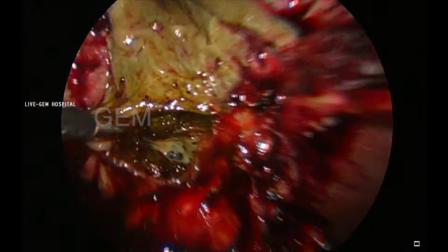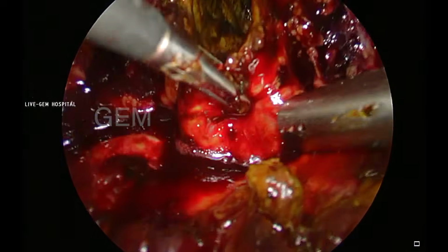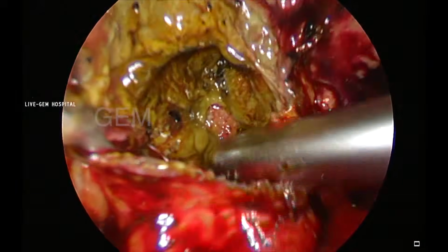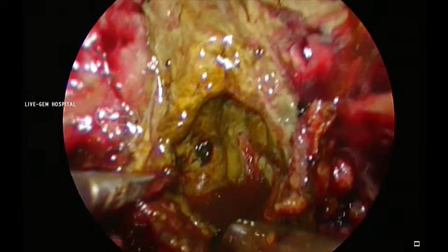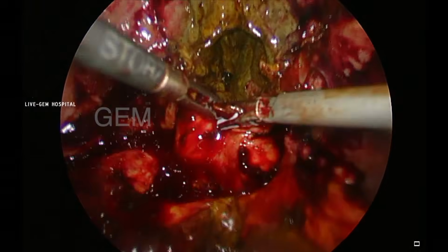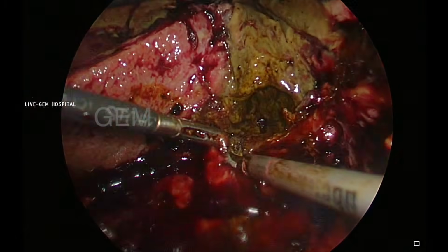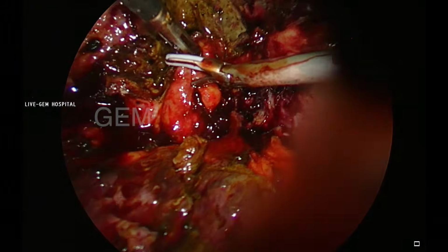Otherwise, what happens? If you leave the mucosa without taking it out and suture the infundibulum, the mucosal secretions after some years, maybe 3 or 4 years, the patient will have a distended infundibulum with a collection inside, the mucosal secretion. On the ultrasound, it looks like a gallbladder. So the sonologist, who knows there is a history of cholecystectomy, will give the report as a remnant gallbladder.